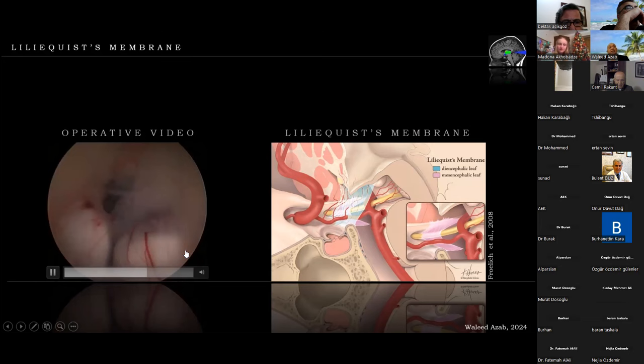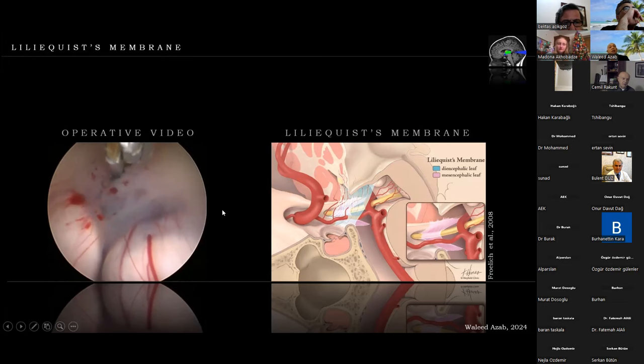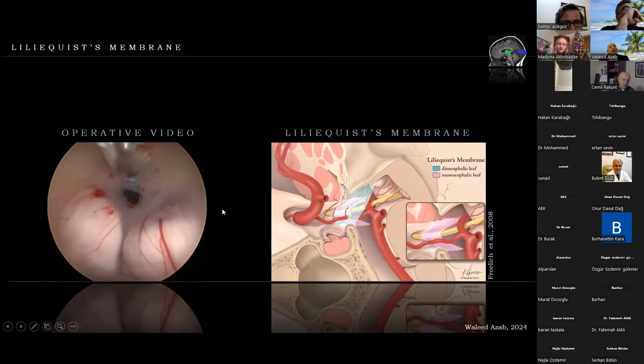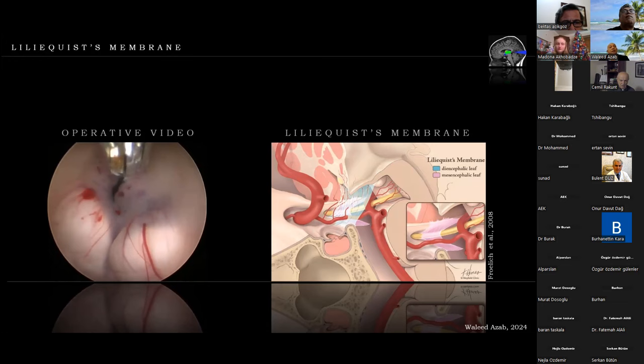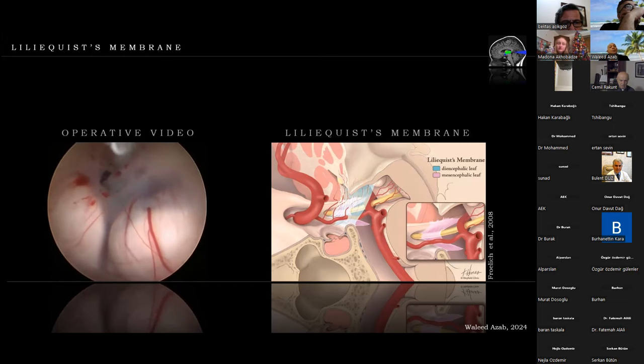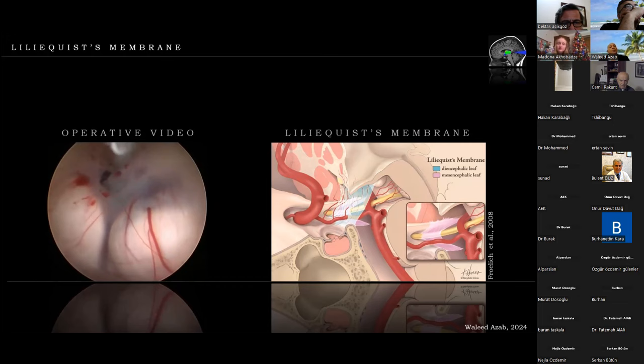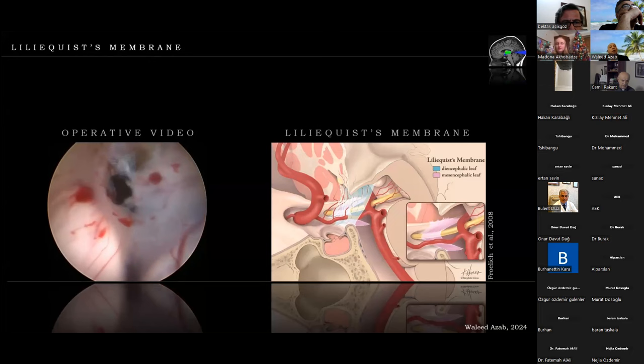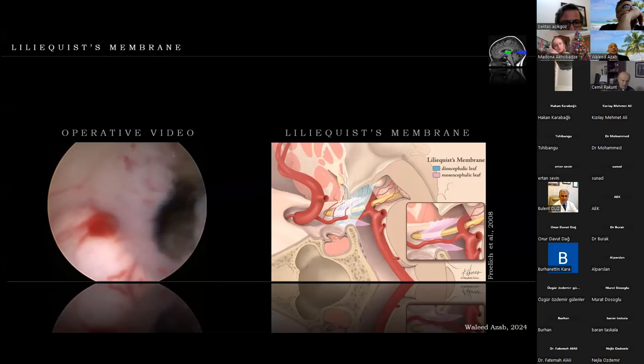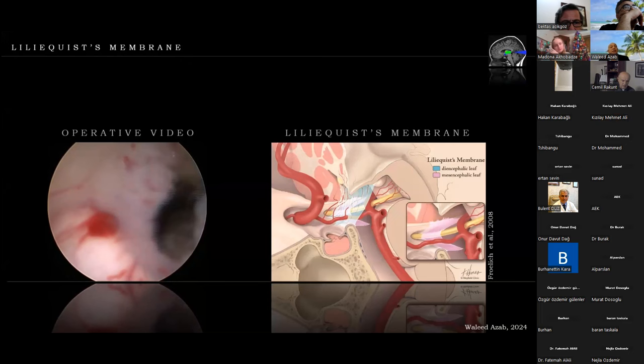However, in this case it is not yet open — there is a large band that remains. So scissors are used to open the Liliequist membrane. Note that the blades are directed in an anteroposterior direction, which is safer. The membrane is cut — even resisting the scissors — and now it is completely open. A view into the stoma, the prepontine cistern, and the basilar artery is obtained.